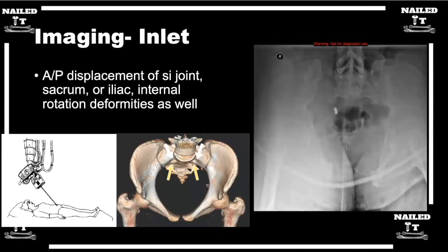Looking at an inlet — and if you have a 3D reconstruction, you can turn it so it's an inlet — what are some of the things that you pay attention to on an inlet image? Look at the joints and the disruptions, and if there are any fracture lines that you can follow, look at those. The other thing that the inlet will show you in particular is the rotational moment. If you look at the iliac spines and their profiles and compare them, if they're asymmetric, then there's generally a rotational moment involved with the displacement.